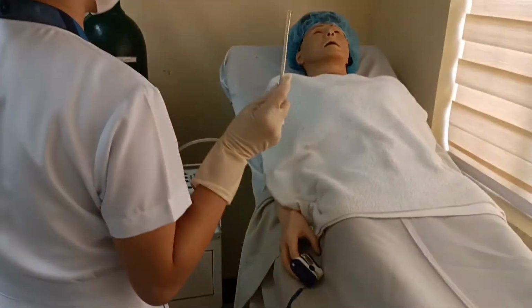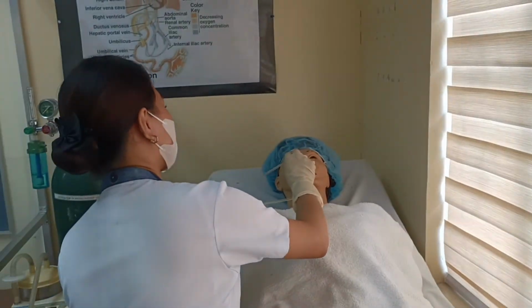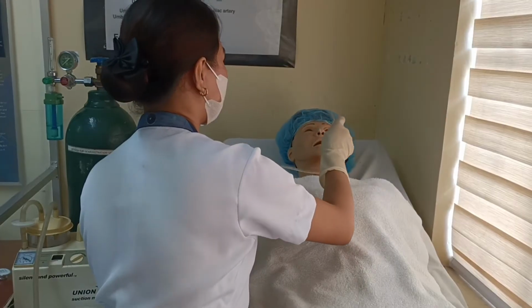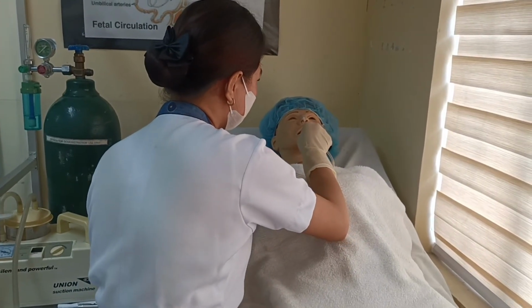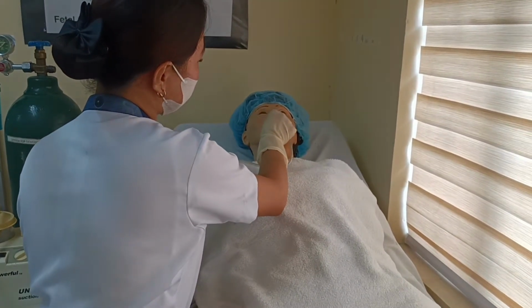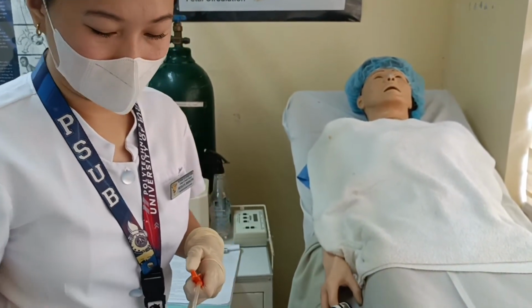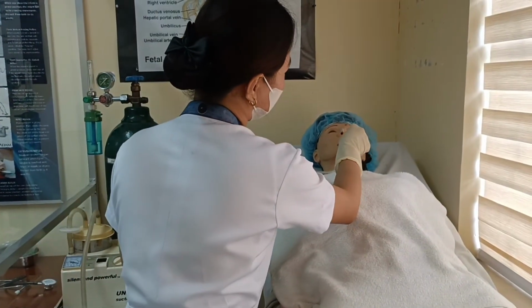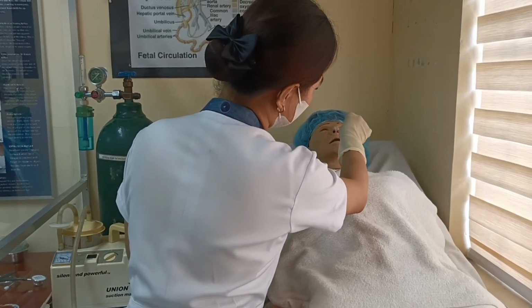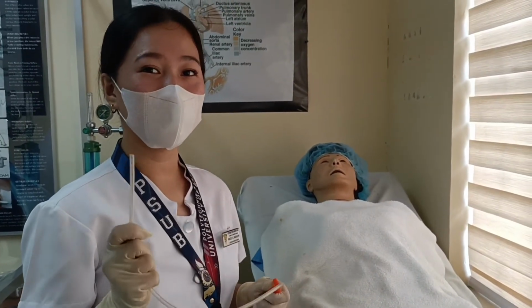Ma'am, can you please inhale deeply? Okay, so let's measure the catheter at least 13 centimeters. Okay, ma'am, I am going to insert. Then rotate. Then flush. Then in another. Then let's make sure that no secretion is left.